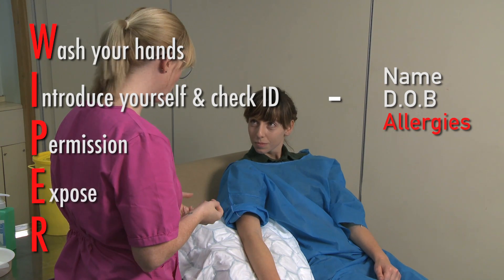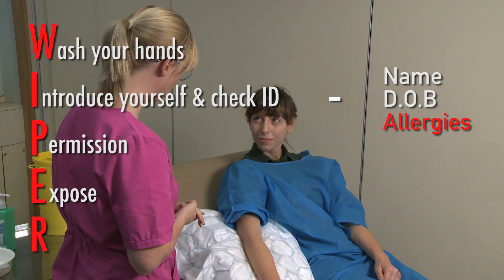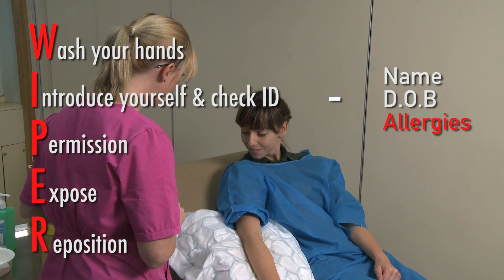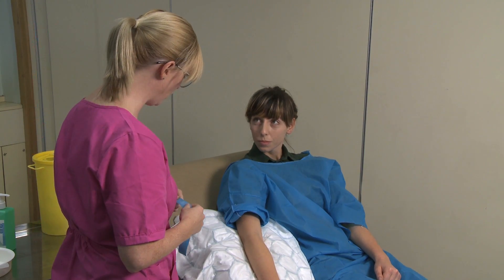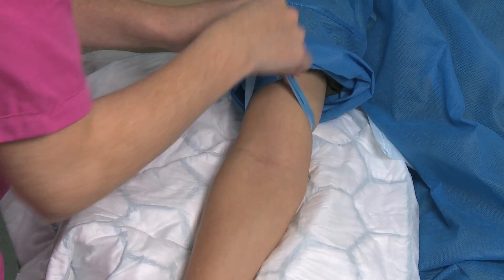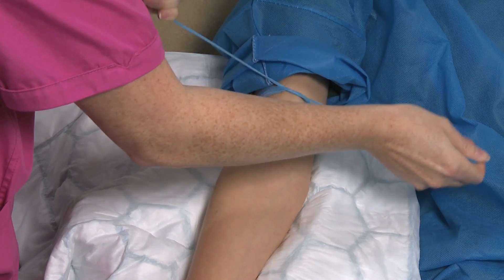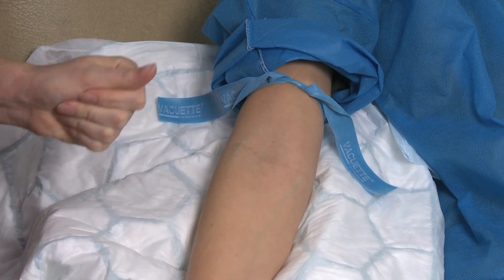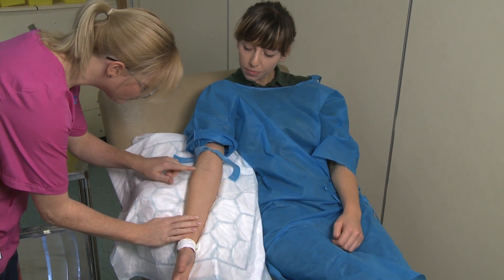Expose both arms and choose a suitable site for venipuncture. Reposition the patient, making sure that their arm is fully supported and comfortable. Ask the patient if they have a preferred arm. Apply the tourniquet to the arm approximately four fingers width above the elbow. At this early stage, it is recommended that you look at the patient's veins in order to ensure you feel confident in carrying out this procedure.